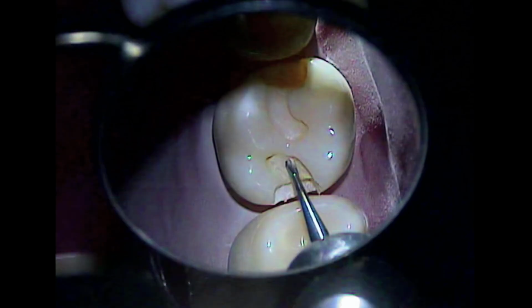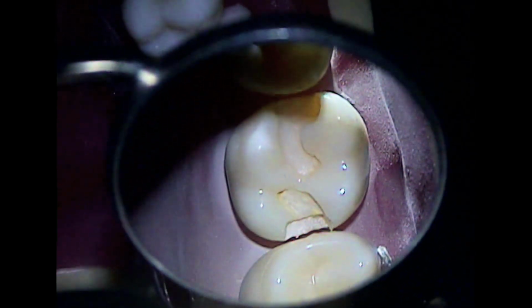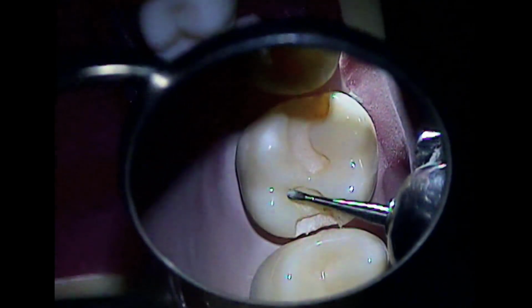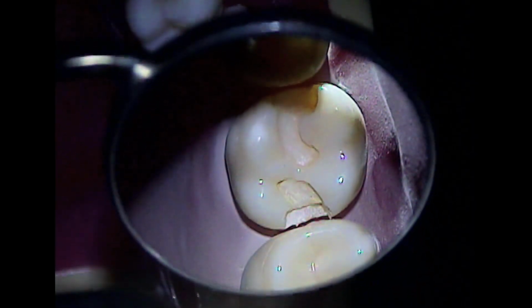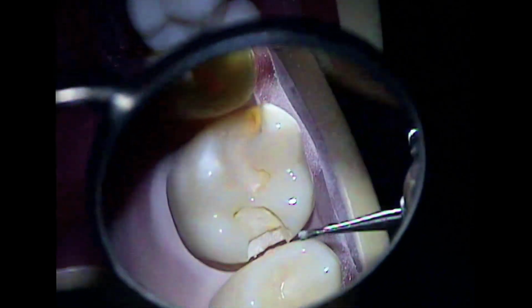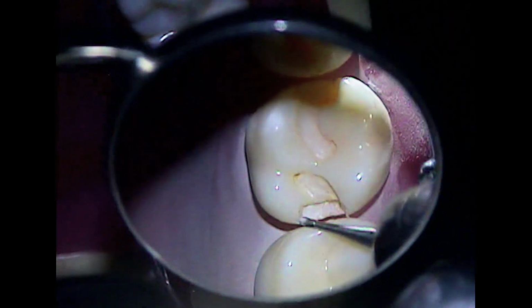Okay, so the pulpal floor is right here. So it's too wide in which direction? Facial lingual. Okay, it's too wide this way? Yeah. Maybe it's more too wide this direction. It's overextended toward the oblique ridge. On the other hand, the clearance on the facial is very, very little, isn't it? Okay. I can make it more. Maybe only 0.1 or so. Over here, it's a little better.